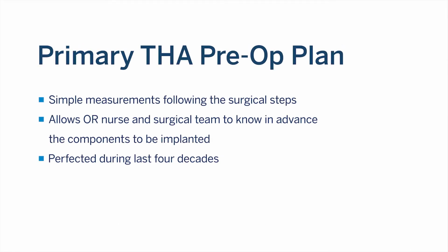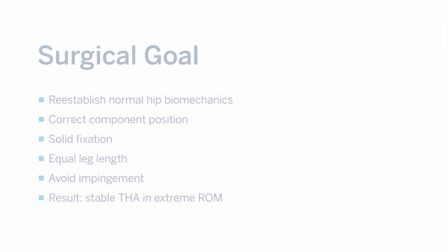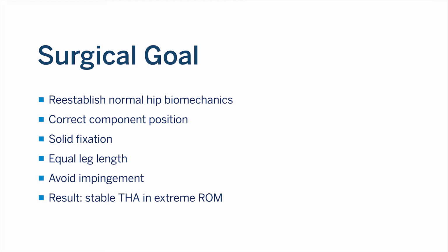The preoperative template is an essential part of the preoperative planning. They include simple measurements following the surgical steps that allow the OR nurse and the surgical team to know in advance the components to be implanted. It's a technique that has been perfected during the last 4 decades. The surgical goal is to re-establish the normal hip biomechanics, correct component position, solid fixation, equalization of leg length, avoid impingement to result in a stable total hip in extreme ranges of motion.